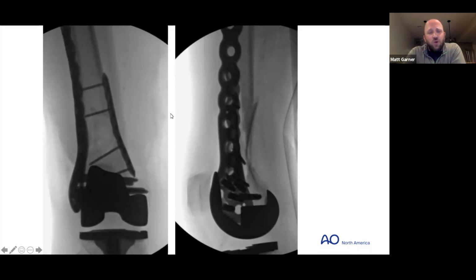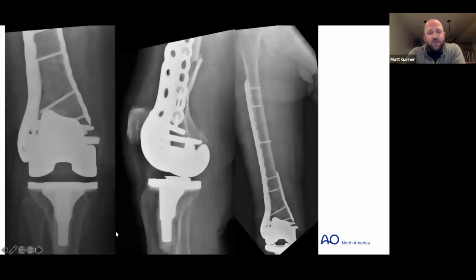It does force your starting point more posteriorly. There are ways to correct for that and try to adjust for that. And some of the newer implants have a more aggressive bend. As far as assessing the stability of the implant, I just like to make a plug for anybody out there who's comfortable with revision arthroplasty and trauma at the same time. I think having somebody like that manage these injuries can be really helpful because they can make those decisions.